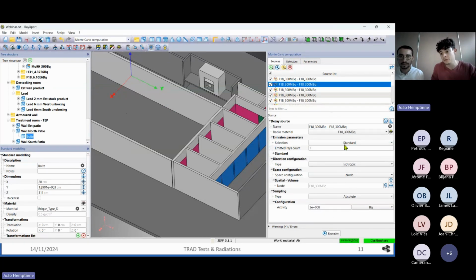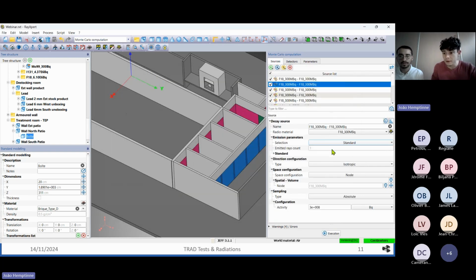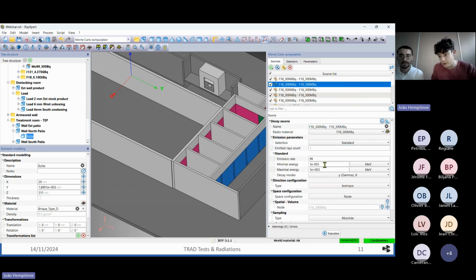When it's over, you have to set which rays of the radioisotope, which particles and which rays you want to emit. In order to do that, we have two ways to set this, the standard mode and the advanced mode. With the advanced mode, you can directly select the rays that you want to take into account. And with the standard mode, it's pretty much the same thing, but you set an emission rate. Thanks to this emission rate, you will be able to select the rays that you want to take into account.